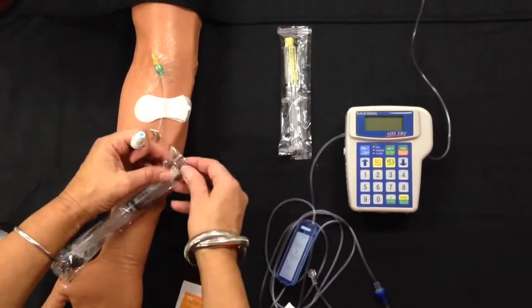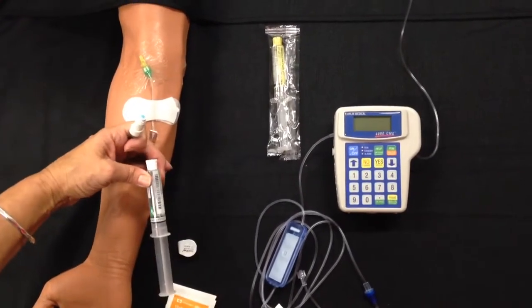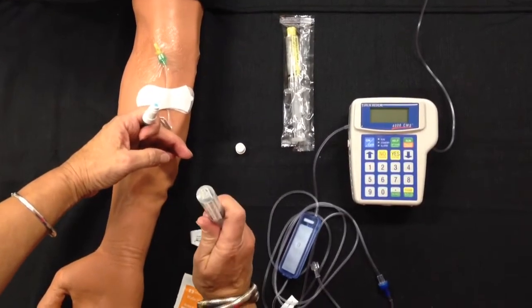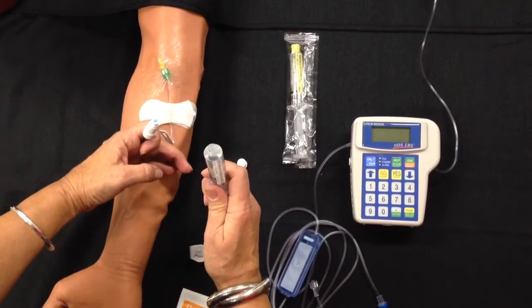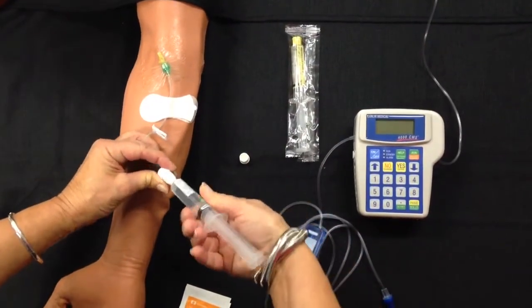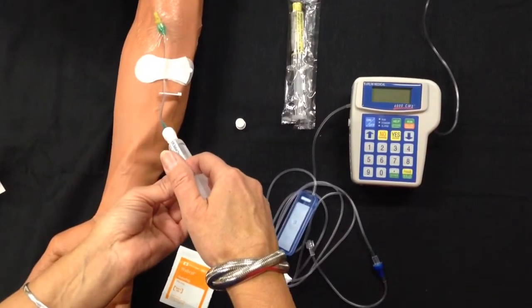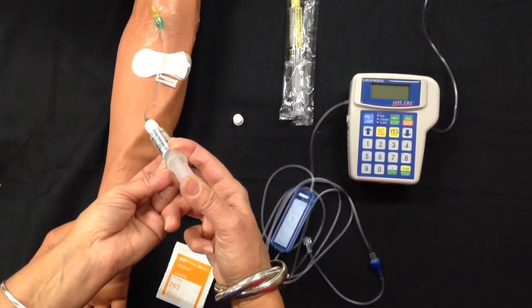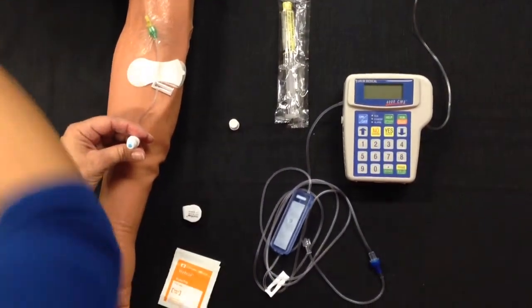Have somebody hold that for you if you need to, or open this before you alcohol wipe. Remove the cap to the saline syringe, and again pull back on the syringe to break the suction and push the little air pocket out the top until there is fluid at the top of the syringe. Providing you haven't touched that, line it up, twist, and push. You'll need to unclamp your line. Since your TPN has been infusing, you shouldn't have any resistance, but push gently at first and then pulse the entire syringe. Disconnect and discard your syringe in your sharps container.